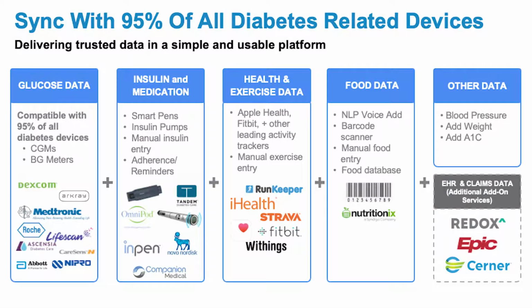Glooko allows clinicians to remotely access a wide variety of patient-generated data in one place, including diabetes devices, blood pressure, medications, and lifestyle data. This access to data, in combination with Glooko's analytics, insights, and remote care tools, allows clinicians to run RPM and telehealth programs for their diabetes patients.